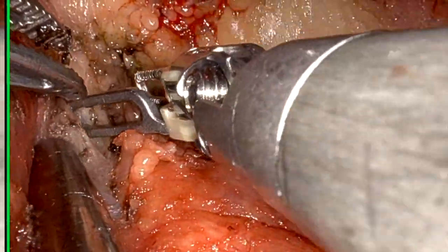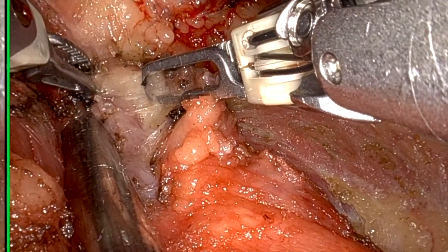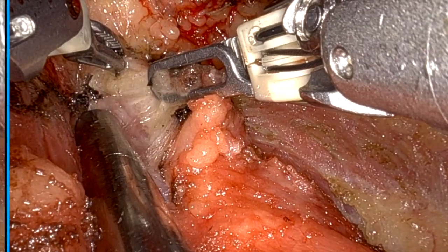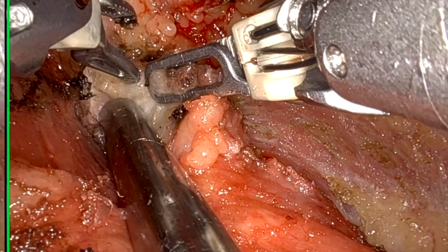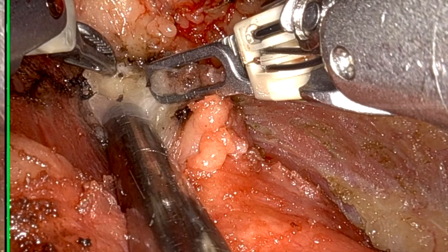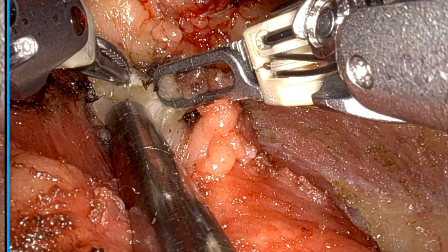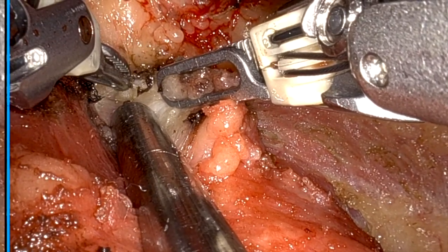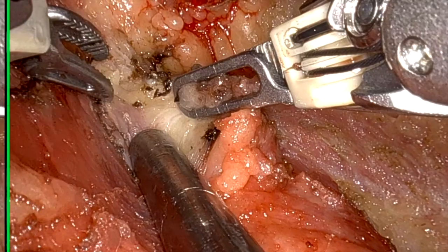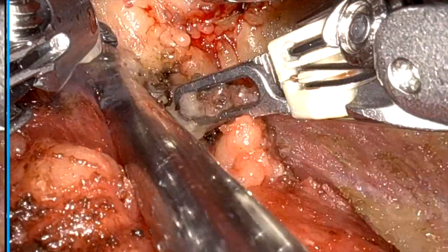We are going towards the apex. You can appreciate the fibers of platysma. You can appreciate the tissue. We are removing level 1A. Now you can see the vessel. I just bipolarized it. So friends, this is the vessel I was talking about. As you go down, you will find many small tiny vessels running vertically. Bipolarize each of them. You will get best field. Can you see the vessel just above my suction? One more.